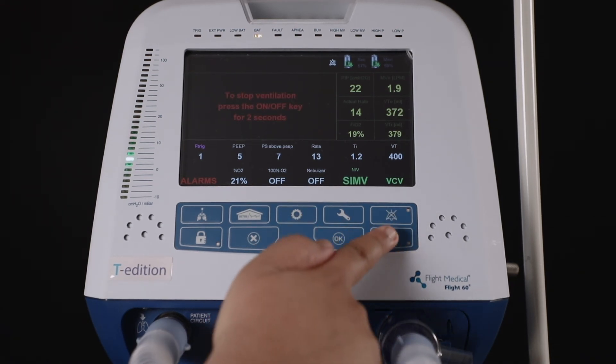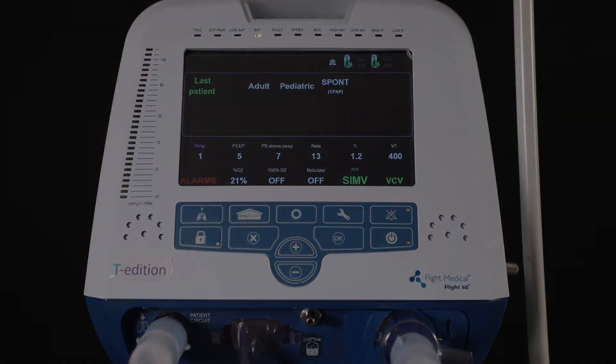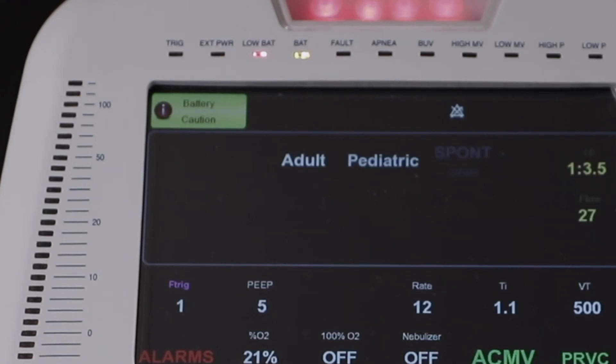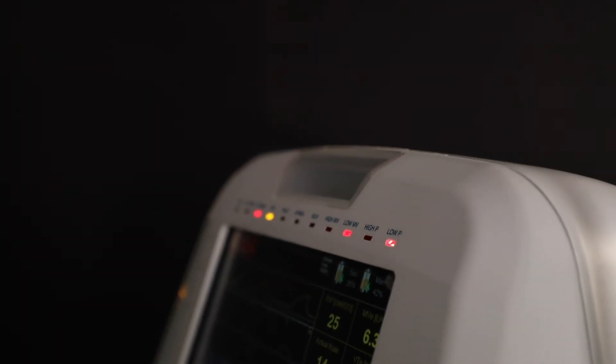To stop ventilation, press the on/off key for two seconds. On the top left of the screen, the user may see a battery alarm, as the battery in this ventilator is low for demo purposes. As you can notice, the ventilator gives an alarm immediately when the battery is low, which is a safety feature.